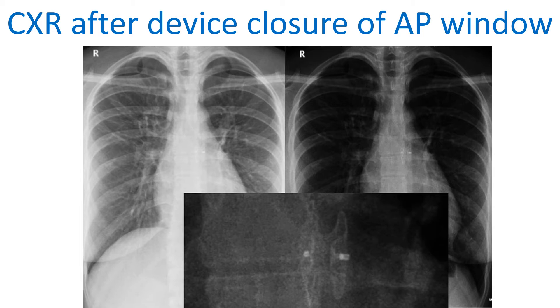It is easy to miss the device on the routine chest X-ray unless one is aware of its presence. The radiopaque markers are barely visible; close scrutiny near the markers makes the presence of the disc of the device more evident. On a film, it will be better seen if it is a penetrated view.